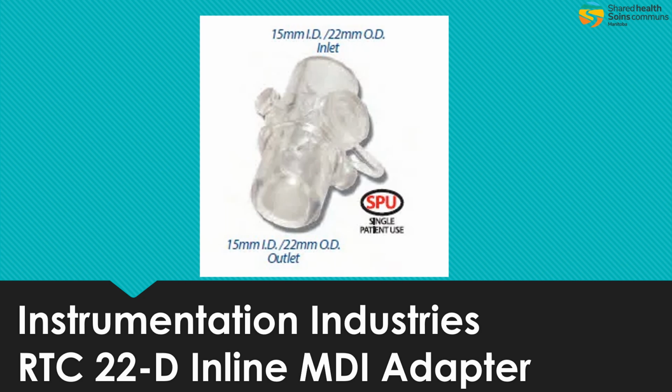As it says in the manufacturer's recommendations here, this is a single patient use device. So if you do use this on a patient, it is only to be used on that one patient. Once you are done with it, it is to be disposed of appropriately.